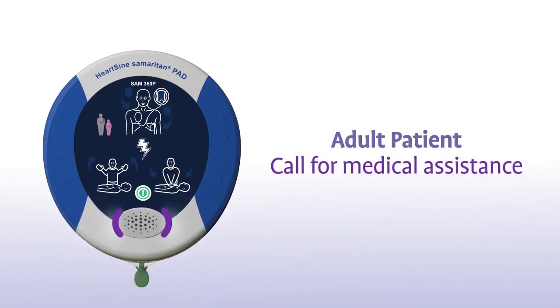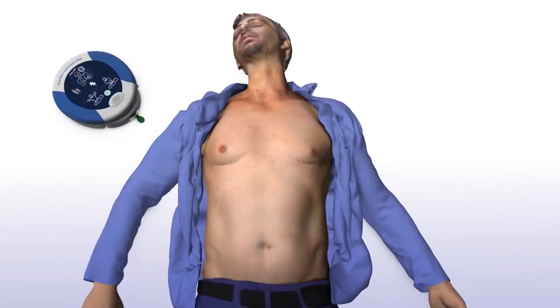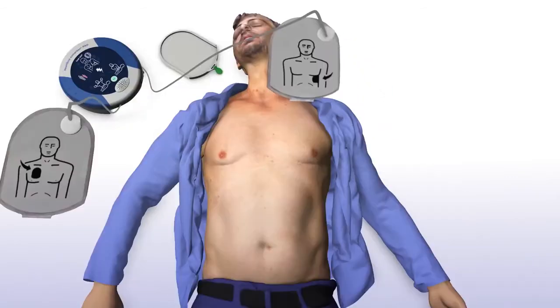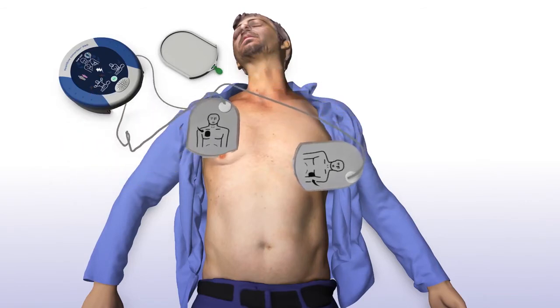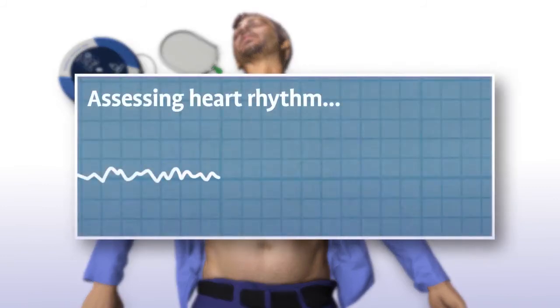Adult patient. Call for medical assistance. Remove clothing from patient's chest to expose bare skin. Pull green tab to remove pads. Peel pads from liner. Apply pads to patient's bare chest as shown in picture, and press pads firmly to patient's bare skin.